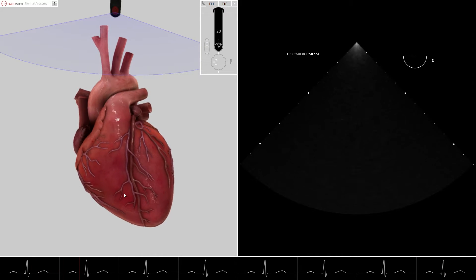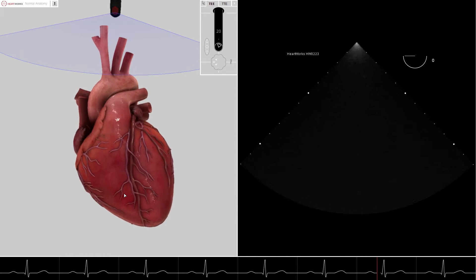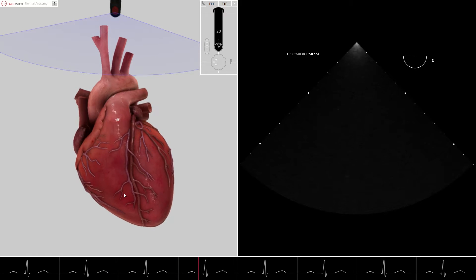Two-dimensional TEE ultrasound anatomy of the mitral valve can be difficult to understand. However, using the virtual reality mode of our HeartWork simulator, we can accelerate learning dramatically.